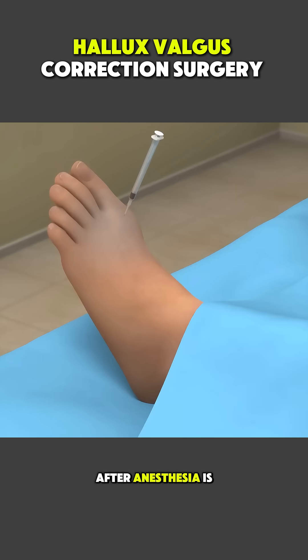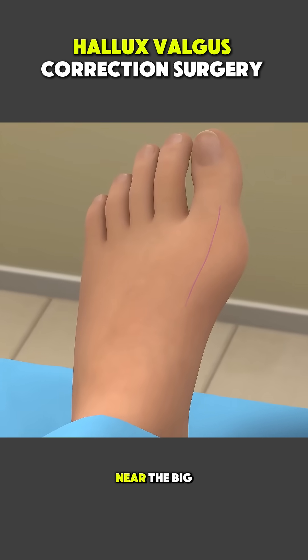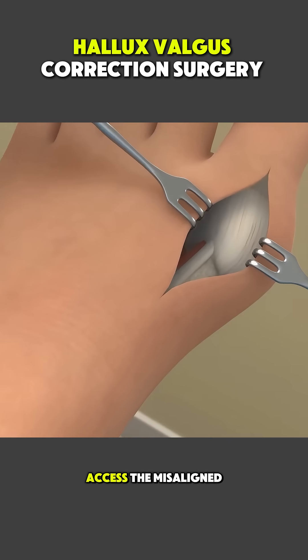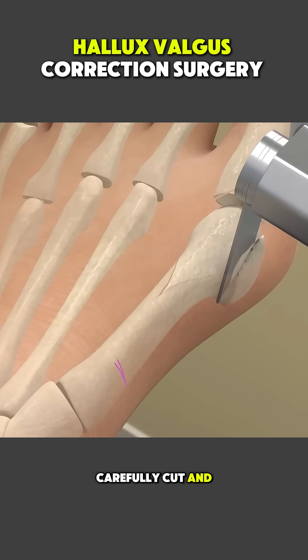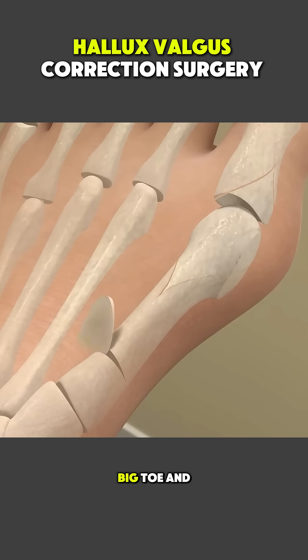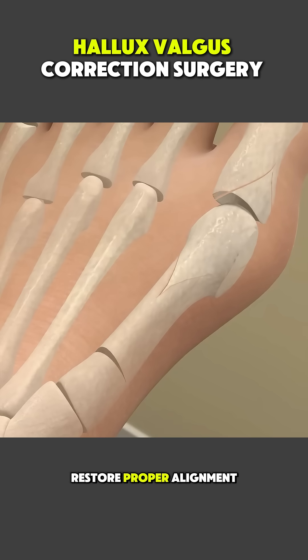After anesthesia is given, the surgeon makes a small incision near the big toe joint to access the misaligned bone. The bone is carefully cut and repositioned to straighten the big toe and restore proper alignment.